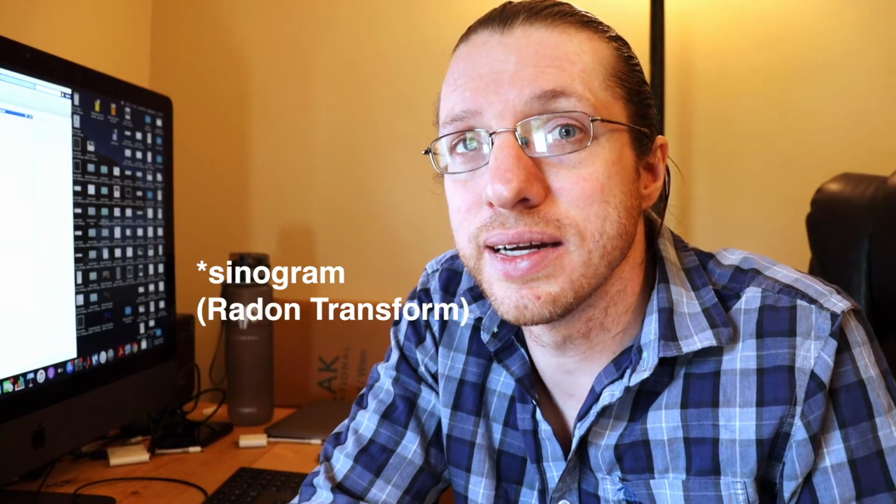You can make up your own phantoms, and you get an analytic form for the sinogram. I would like you to give me a plot of the Radon transform of each of these, so I can just press play and have a whole bunch of figures of shifted, different versions of the ellipses and squares and whatnot.